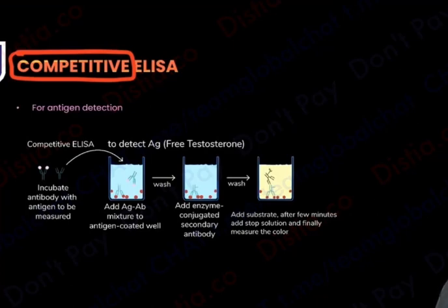So what am I doing over here? If you want to test for antigen, like you say that, ma'am, I want to test for free testosterone levels in a male patient. How much testosterone does he have? So you want to test for some kind of antigen in a person. What will you do? Whatever antigen you had, usse pehle hi bahar finish the course in the library. Don't bring it to the classroom. Class mein aane se pehle, those students who read and come, na. So what have you done?